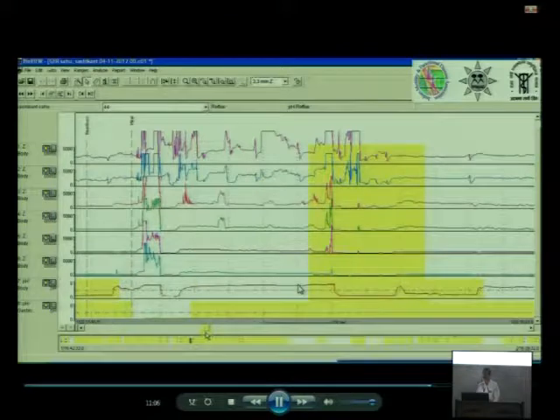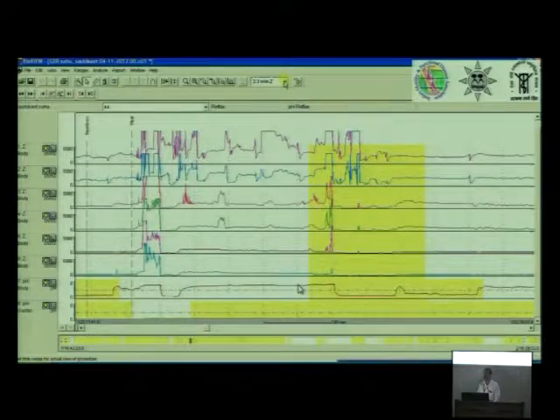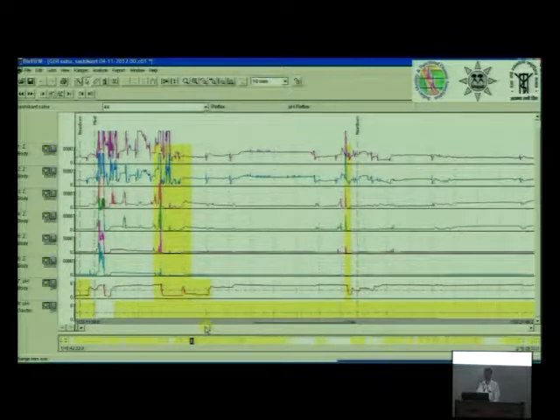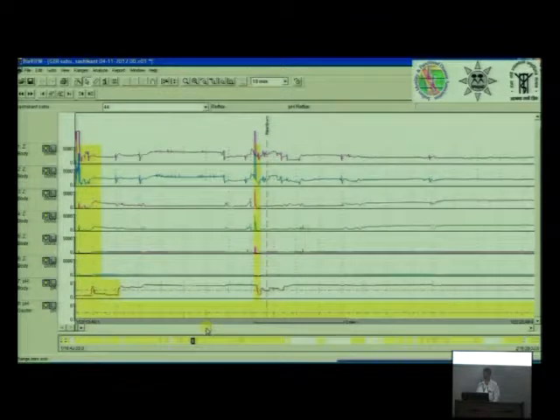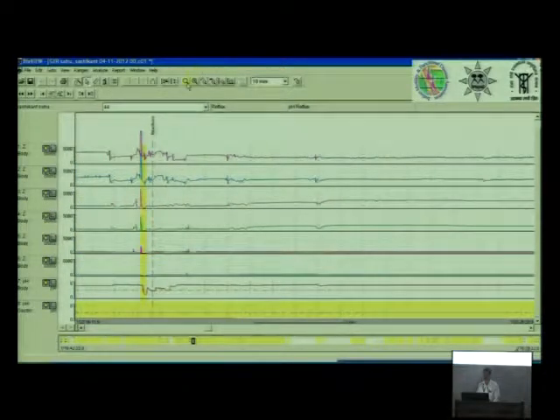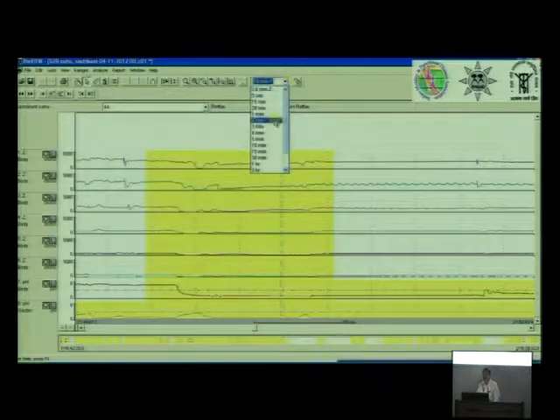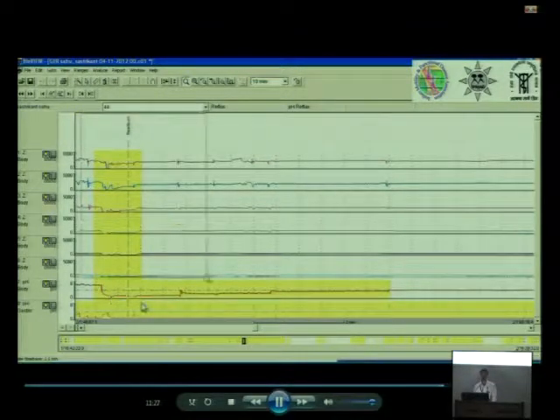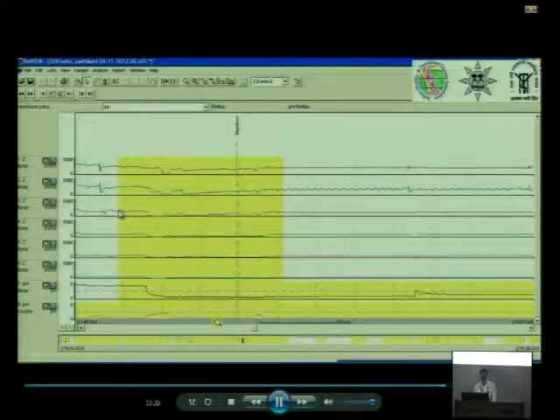So what is the symptom sensitivity index? Symptom sensitivity index is, when somebody has heartburn, how many times there is an acidification of the esophagus. If each time the patient says heartburn, more than 50% of the time the esophagus has become acidic, this is evidence for reflux. Look at this, here again, pH has dropped, impedance has dropped, and the patient has clicked on heartburn.